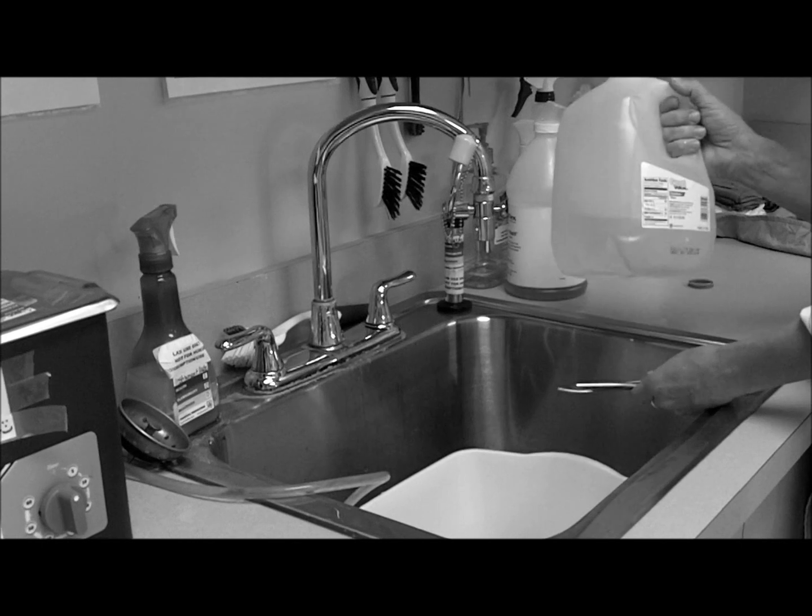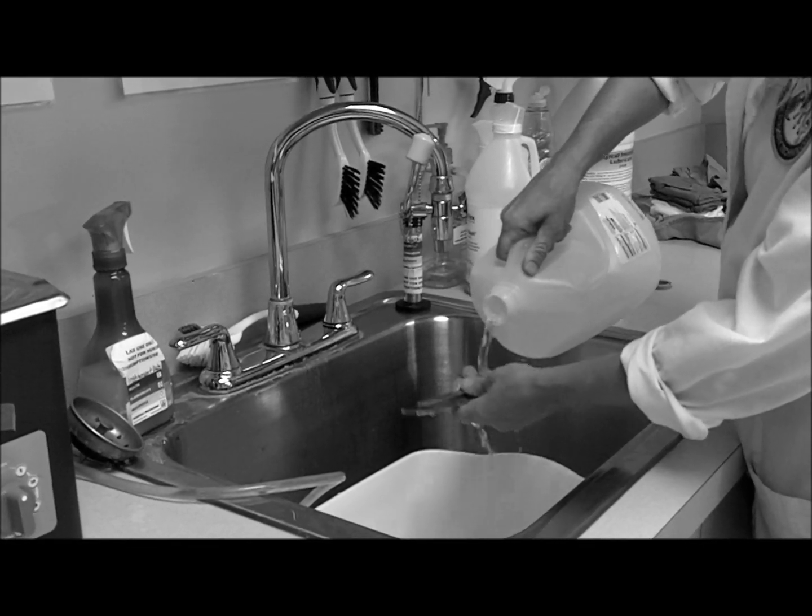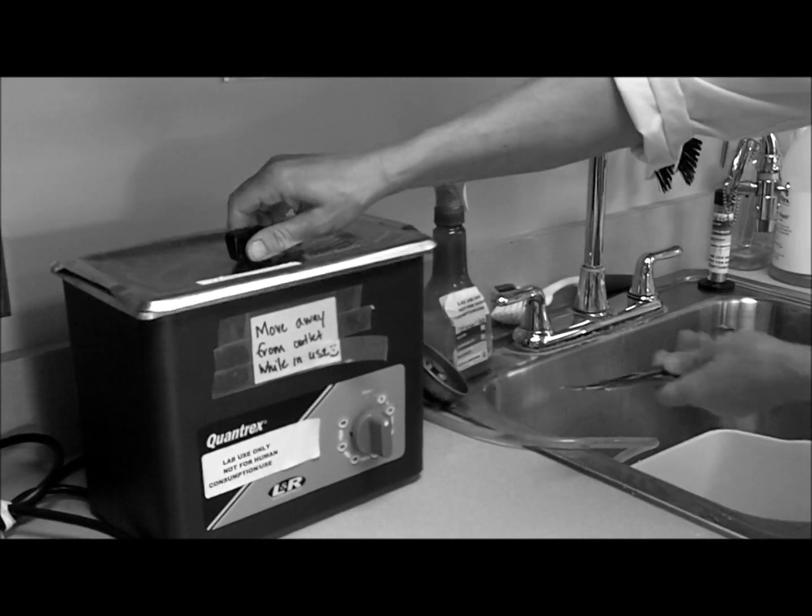Well, that's just neat. Next, you take the distilled water and you rinse your instruments. Then you put them in the ultrasonic cleaner.